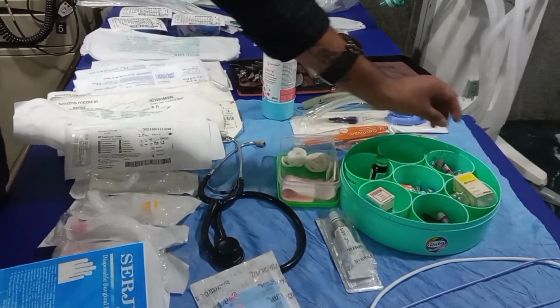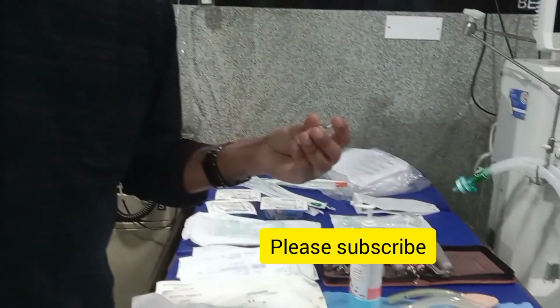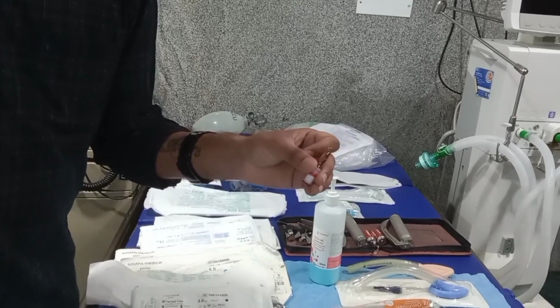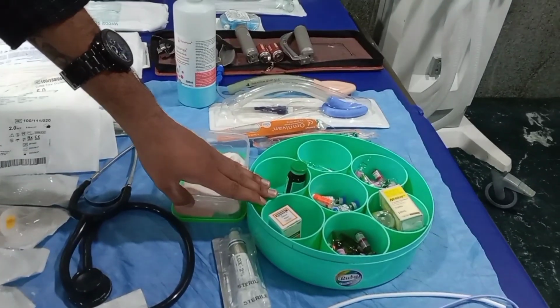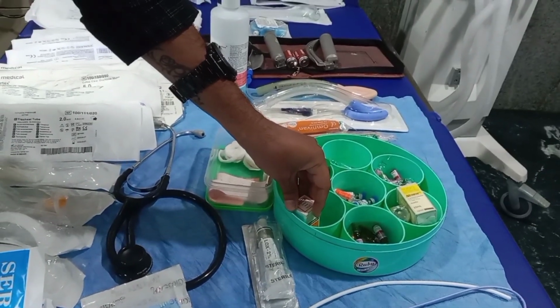Prior to sedating the patient, we should make sure that we have the emergency medications in hand. During sedation, there will be a chance of cardiac arrest, so we should keep atropine and adrenaline loaded for any chance of cardiac arrest. We should be prepared. Once you keep it loaded, we should make sure that we use sedation on the indicated patient only.